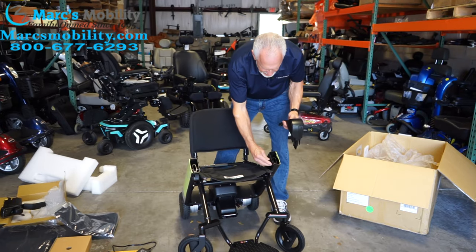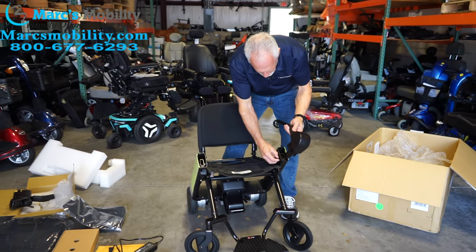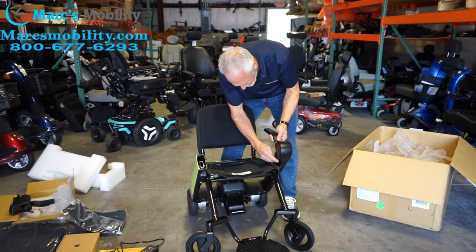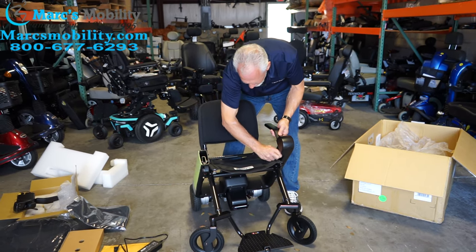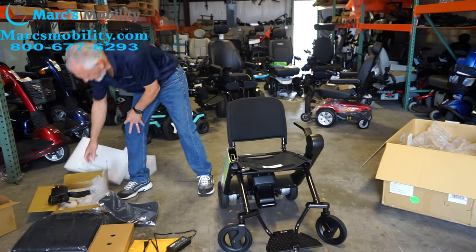When you put the arms on, you've got to take this little screw completely out that's over here, and then you can slide this in here. Put the screw back in and re-tighten it until you have no more play. Same thing with the other side.